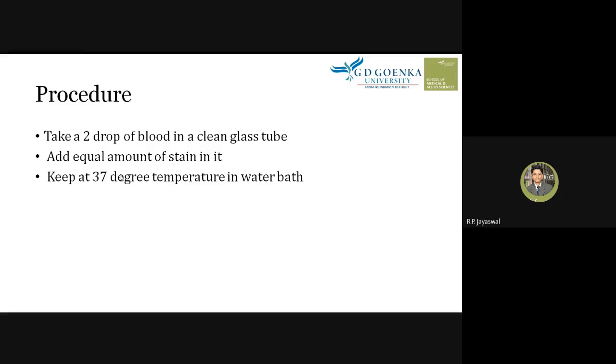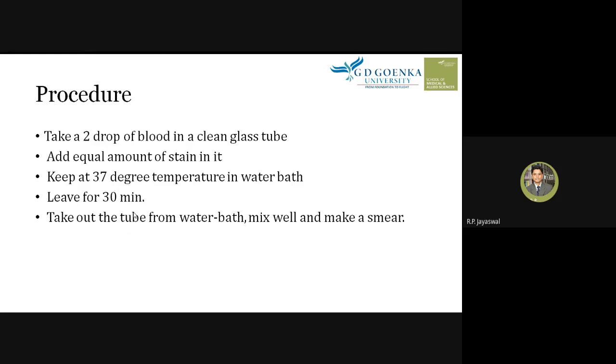Then keep it at 37 degrees Celsius in a water bath. This is the incubation temperature where you can incubate it for at least 30 minutes. Okay, at least. During this period, at this particular temperature, the stain enters into the cytoplasm of reticulocytes, and if there is RNA, then it binds with the RNA, and under the microscope we will be able to find it. Now, after the incubation, take out the tube from the water bath, mix well, and make a smear.